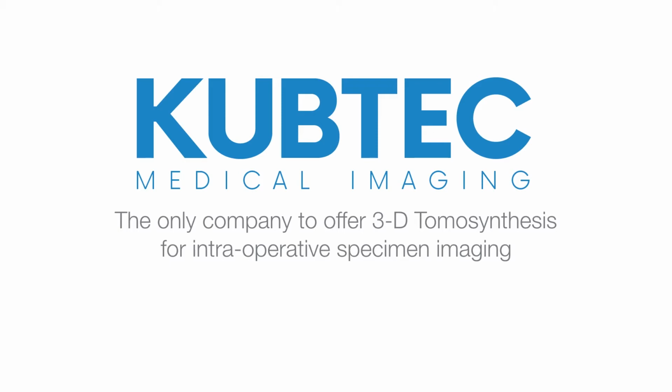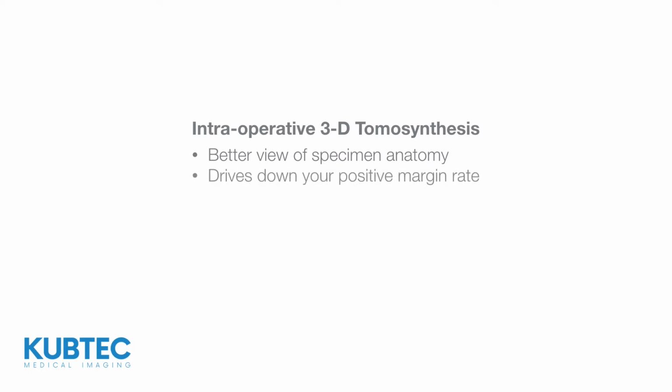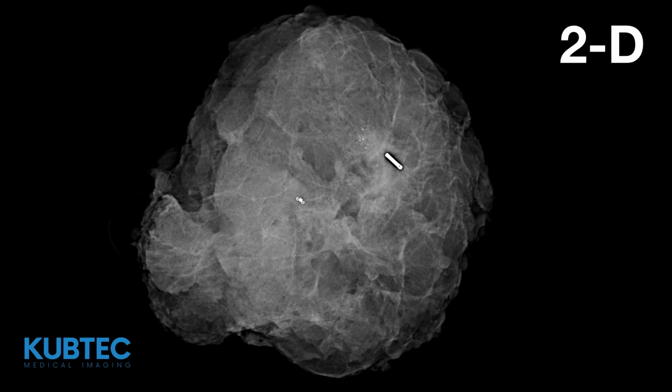When compared to traditional 2D specimen imaging, intraoperative three-dimensional tomosynthesis gives surgeons and radiologists a better view of the specimen anatomy and enables a reduction in positive margin rates.